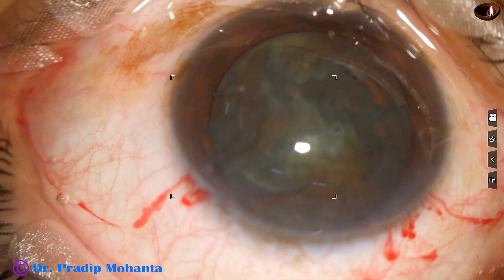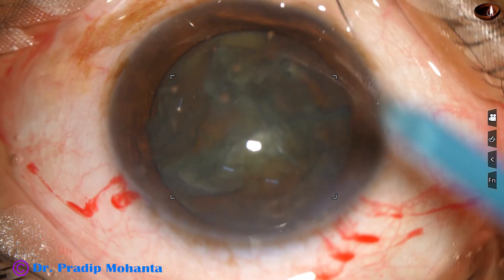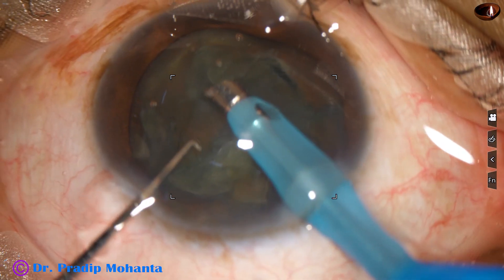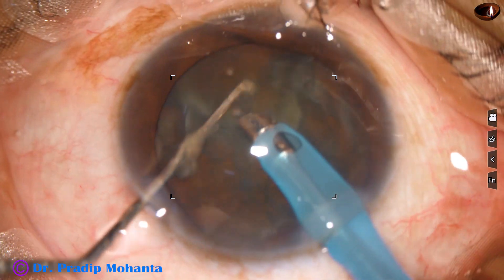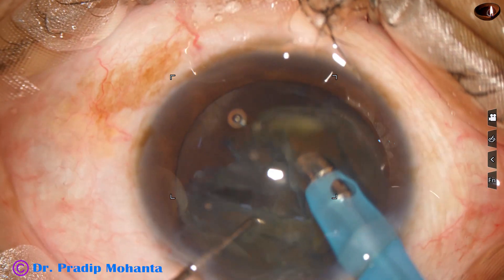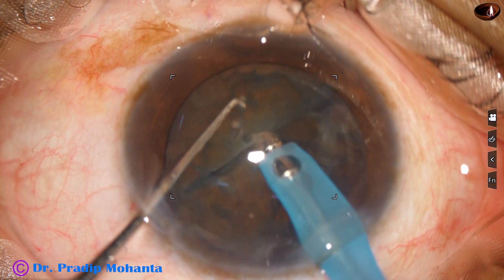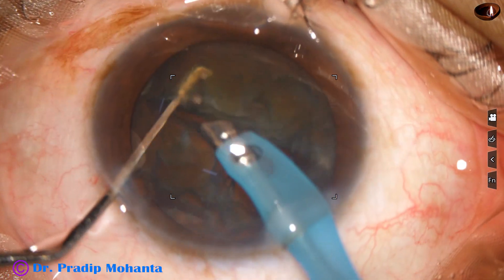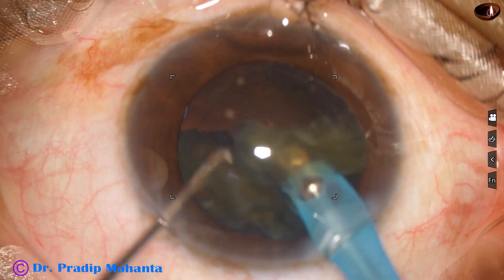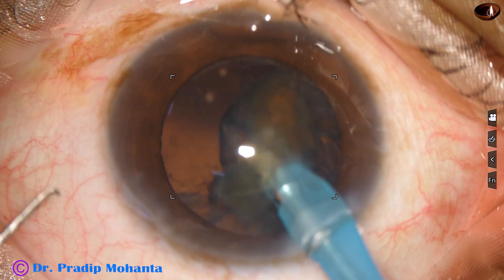Now it's time to introduce the phaco handpiece. The phaco needle goes in with its bevel down. Some superficial lens matter is removed, and then one piece is picked up and emulsified, then the other piece. I come to the other hemi-nucleus and start emulsifying it from one side, and it gets removed in no time.